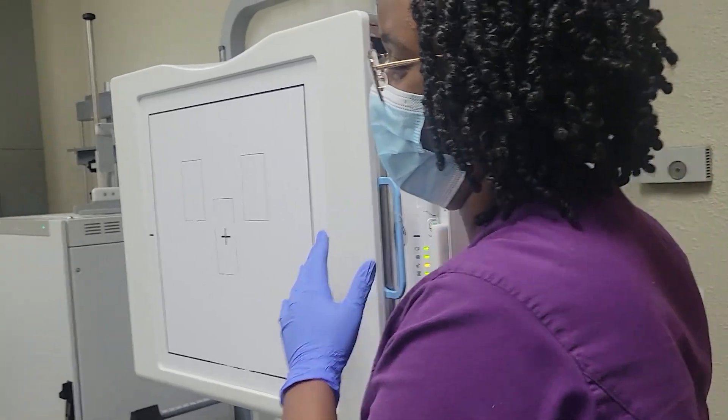I'll be explaining each point as I go along so that you know why you're doing certain things — it's one thing to see it, but another to know the reason behind it, making you more intentional in how you position your patient. The next thing to prevent rotation is to ensure the patient's stance is perpendicular to the image receptor or bucky. You don't want one foot further forward or the patient standing at any angle other than 90 degrees to the board, because even after you step away to the console, they will naturally twist into a more comfortable position.